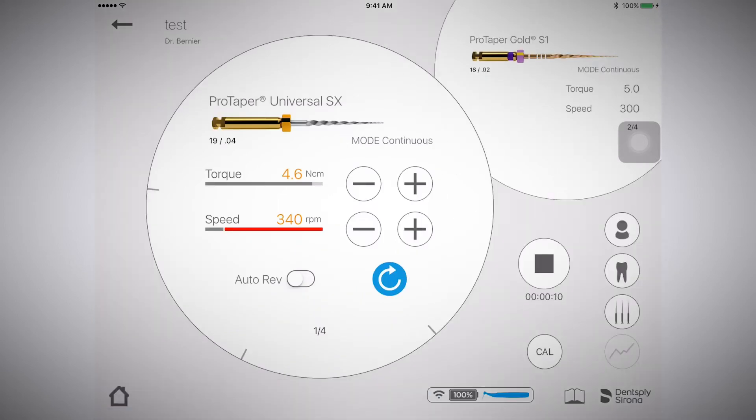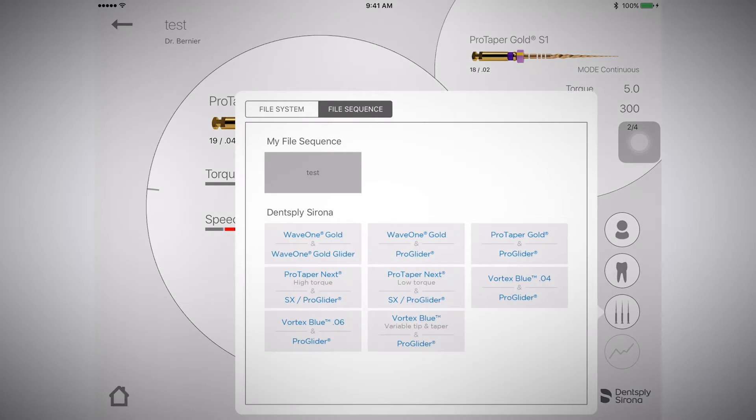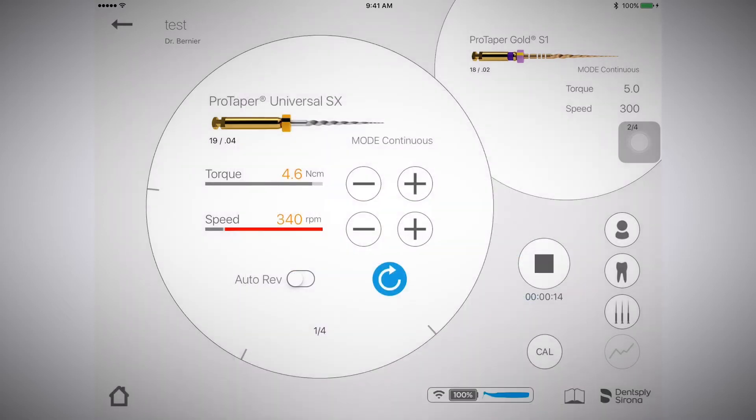Now, select the icon with the three files. Here, you will select a preset file system or sequence or select a custom file sequence you have already set up. You will see that the file system or sequence you selected appears.